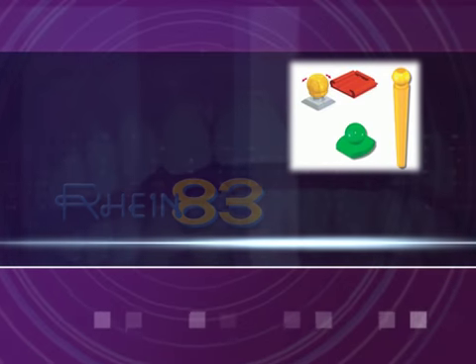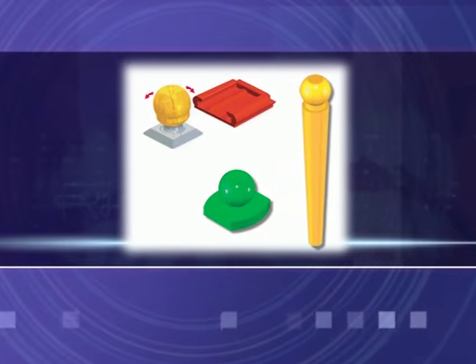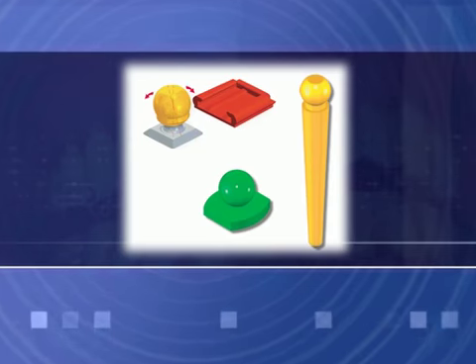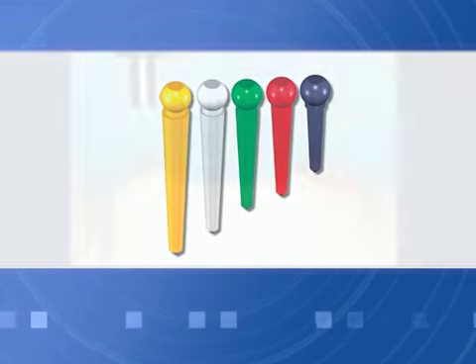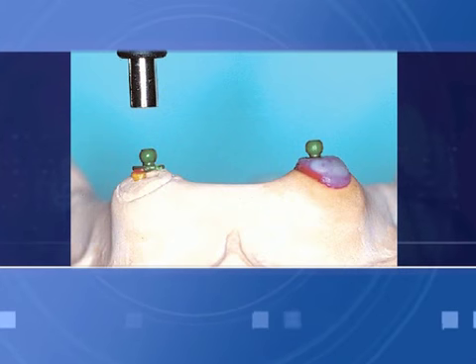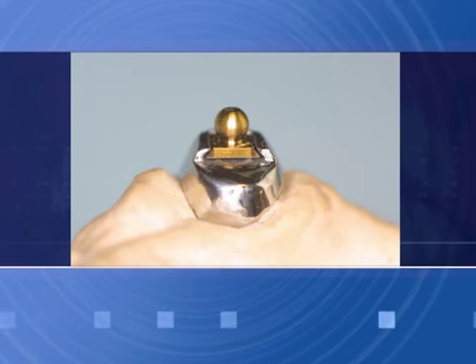Over denture roots: single spheres, posts, castable spheres, cast root posts, single titanium spheres. Lab technique to produce single cast posts over roots without welding, using castable and titanium single spheres positioned in parallel to each other.